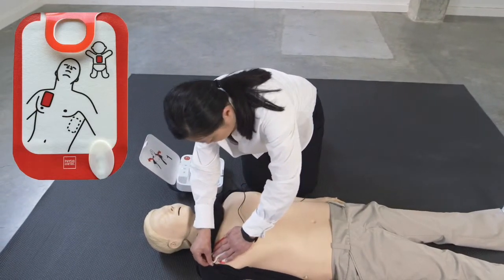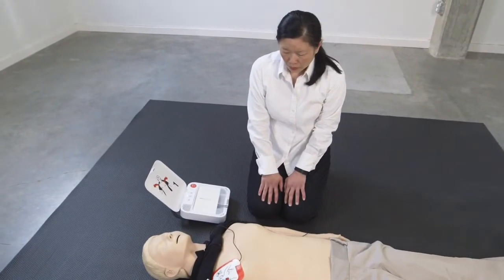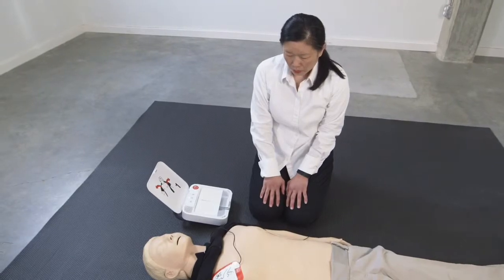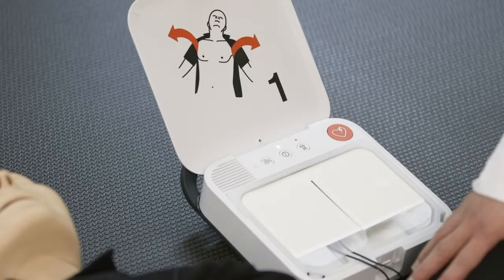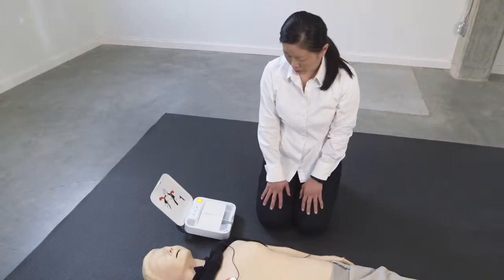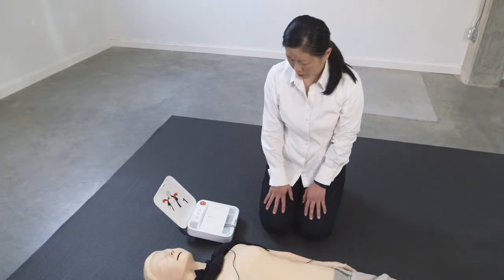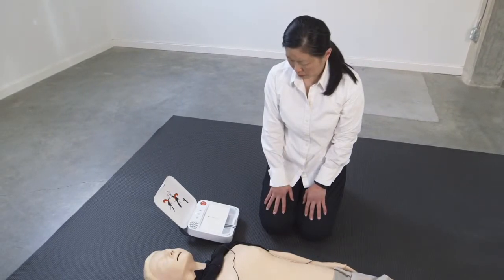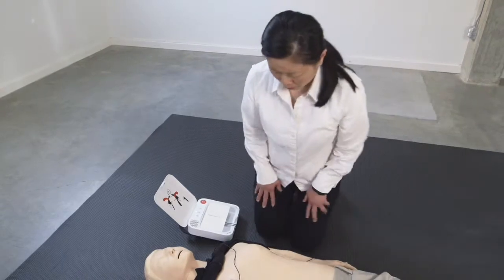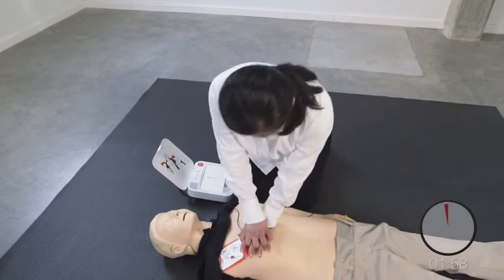Press pads firmly. Do not touch patient. Analyzing heart rhythm. Preparing to shock. This device will deliver a shock automatically to the patient. Everyone clear. Do not touch patient. Delivering shock. Shock delivered.